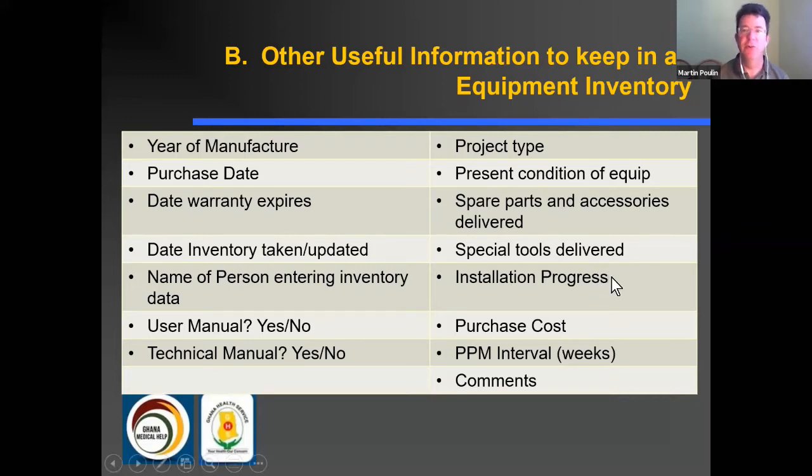And perhaps you want to track the installation of the equipment. And of course, the purchase cost, or at least the value or the replacement value of the equipment is very important. And also, what is the preventive maintenance interval that you hope to regularly inspect the device?